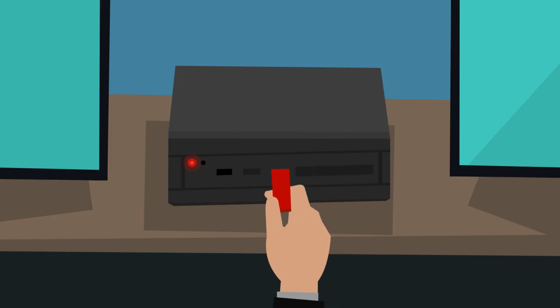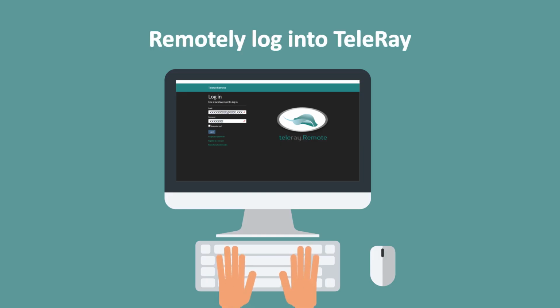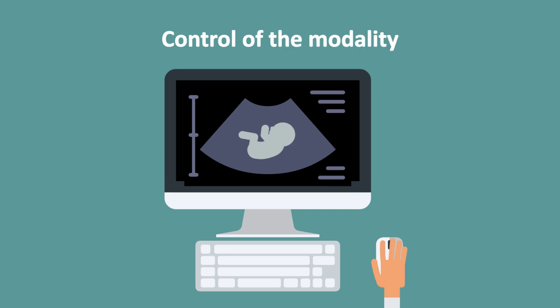Plug in video source and USB. 2. Remotely log in to TeleRay. And 3. Take control of the modality.